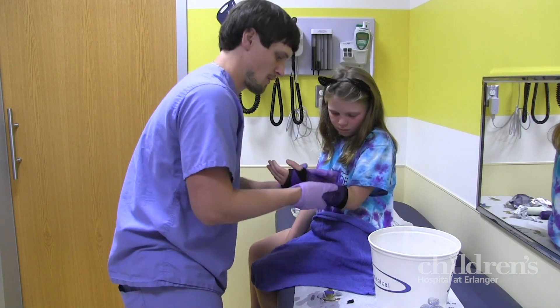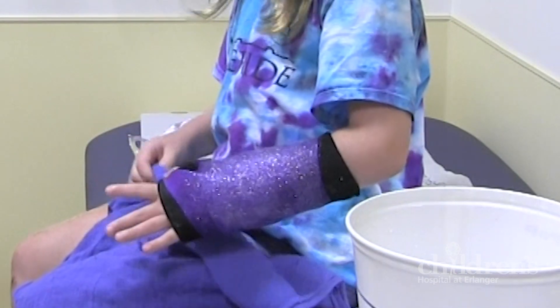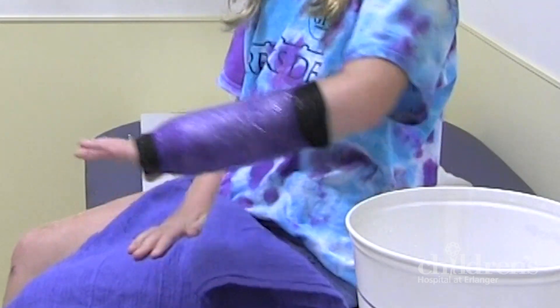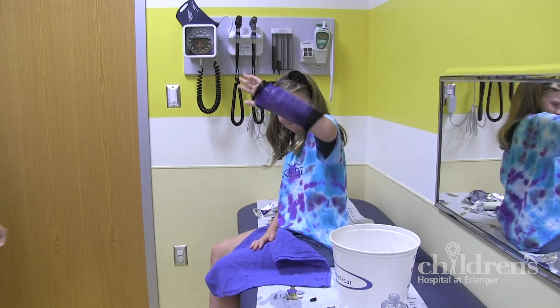This last layer can also be decorated with glitter, stickers, drawings, or whatever makes the cast look the way you want. And now you're all done — great job! We will give you and your parents special instructions on how to take care of your cast until we see you at your next appointment.